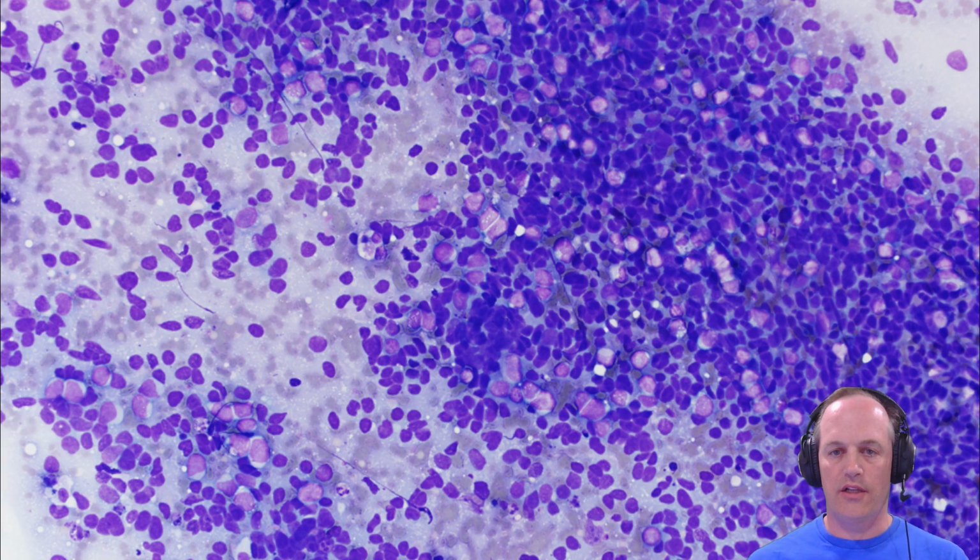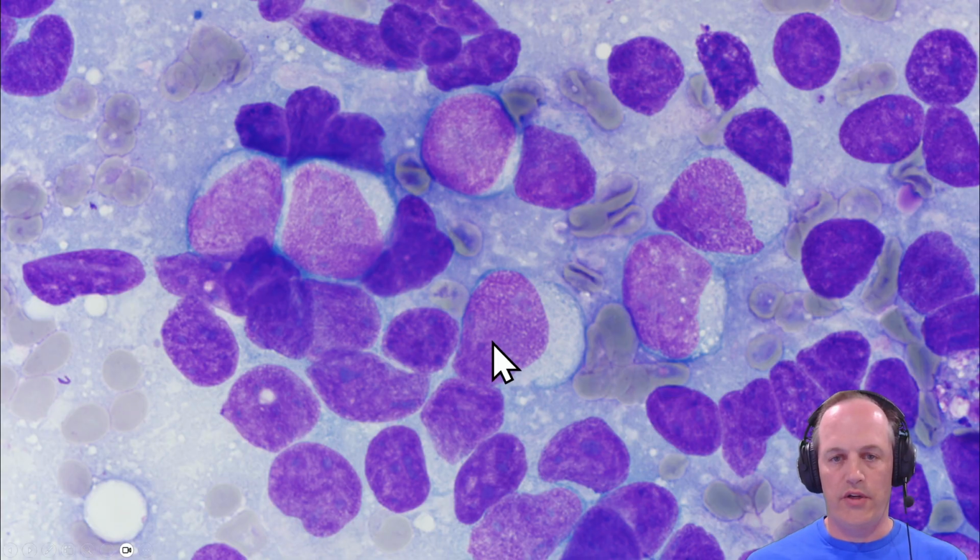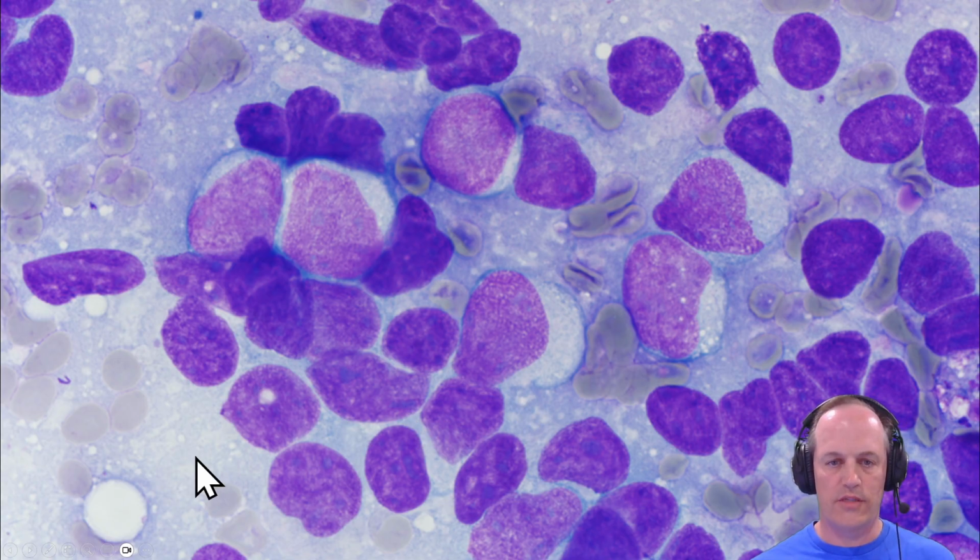So here's my touch prep. I love doing touch preps on these, and right away you can see this is more cohesive. You're seeing cells that are a little piled up on top of each other compared to that lymphoma we looked at. And at high power, you can see you have this very, very homogeneous, very fine chromatin, very immature looking cells. And some of these have a lot of abundant kind of pale cytoplasm. A lot of these, the cytoplasm is kind of broken open and spilled onto the slide.